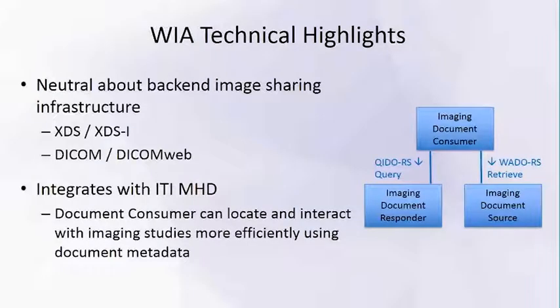In terms of the technical highlights, the actor transaction diagram is actually very simple. We have a consumer that can query an imaging document responder and retrieve from an imaging document source. How the imaging document responder and the imaging document source work on the backend is not specific to the consumer.